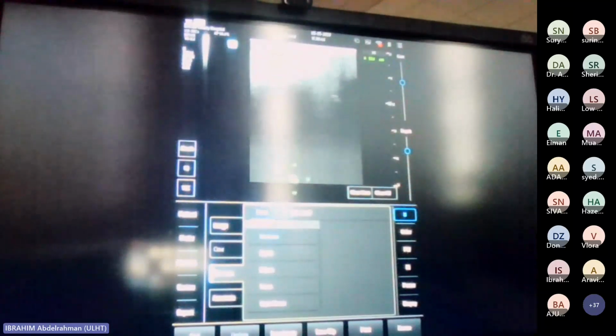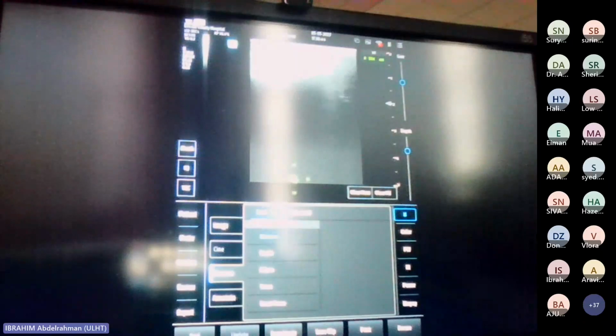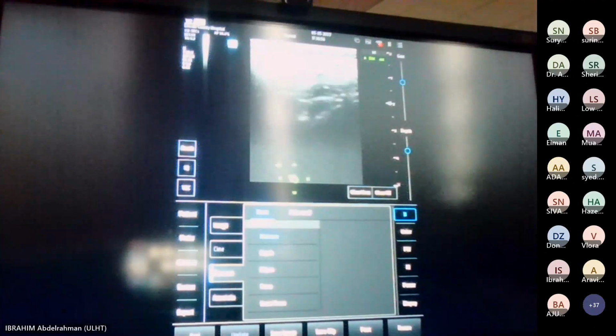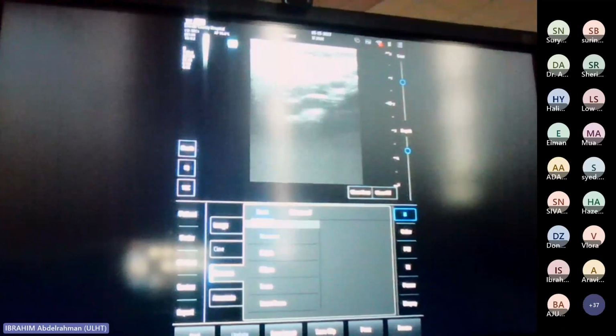If we scan through there, we've got an intraparotid lymph node here, which looks very normal. And as we were talking earlier, some skin SCCs can metastasize to the parotid gland. So if that was involved, that would be easy to access for a biopsy on ultrasound. So this is where I've turned the probe: the posterior belly of digastric muscle, and this is the parotid tail, and this is almost like a sagittal image of the parotid tail.